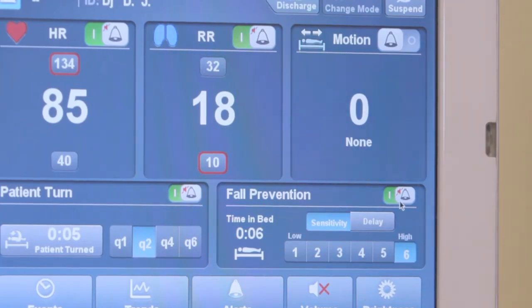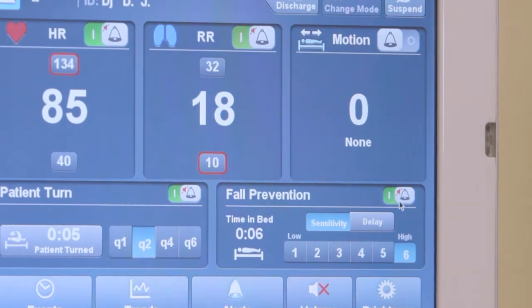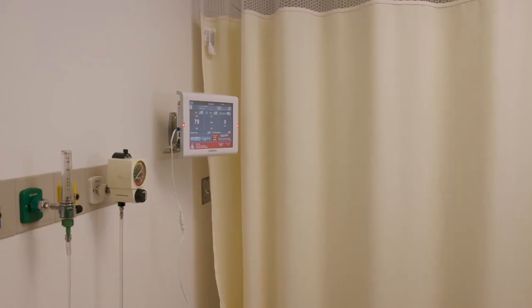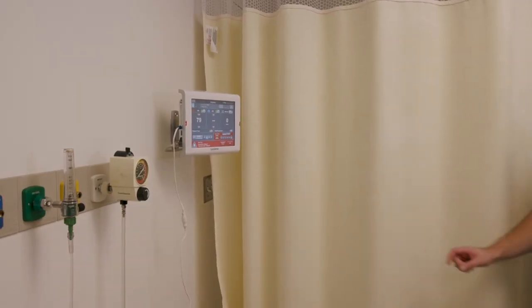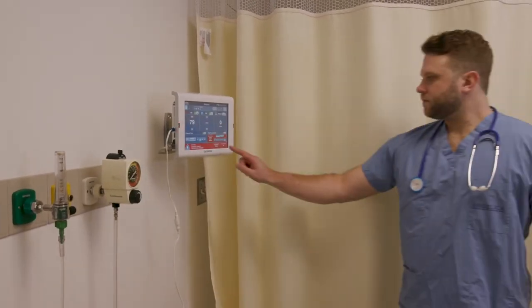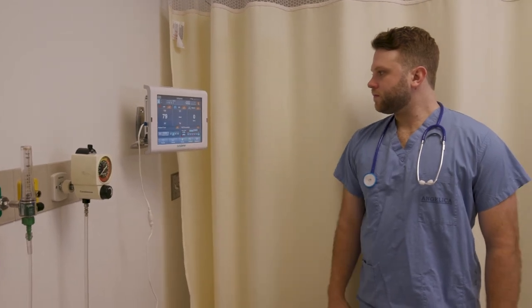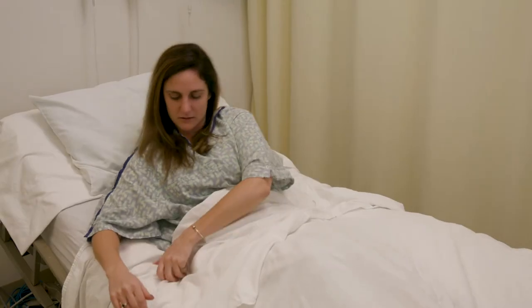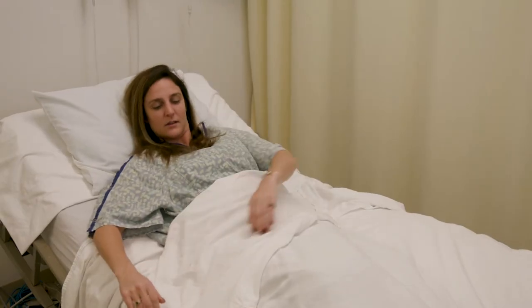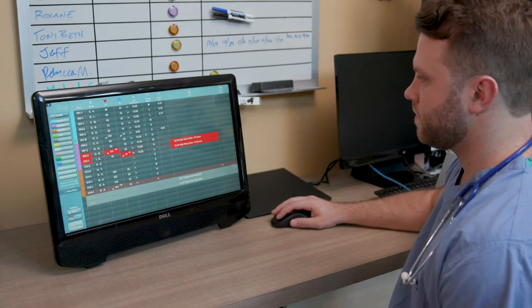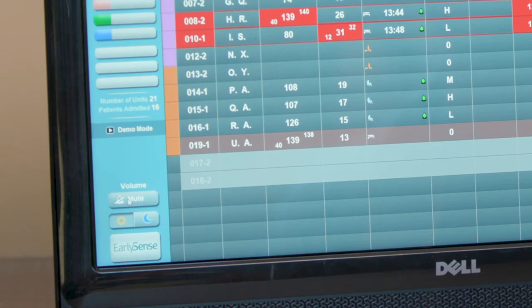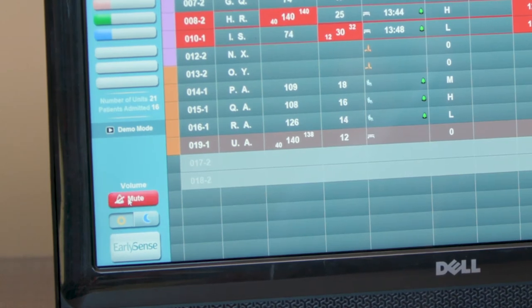When the bell is green, the feature is on. Please note that an alert can only be acknowledged by a staff member at the bedside. A patient returning to bed or staff muting the alert at the CDS will not dismiss it.